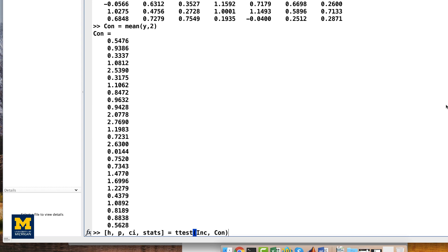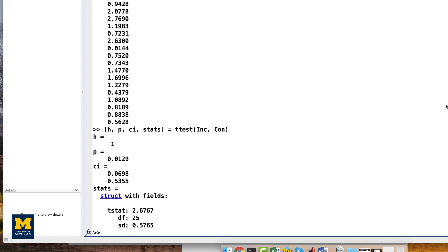If you did everything correctly, you should get the following results, indicating that there is a significant effect. This is basically everything you would need to do to analyze a typical fMRI data set from start to finish using SPM.